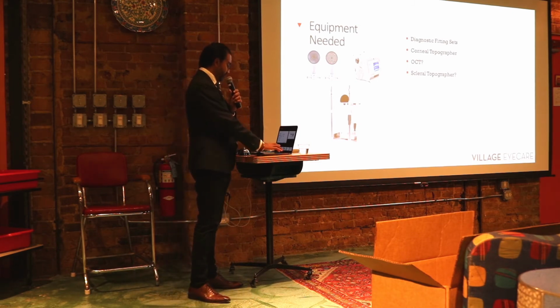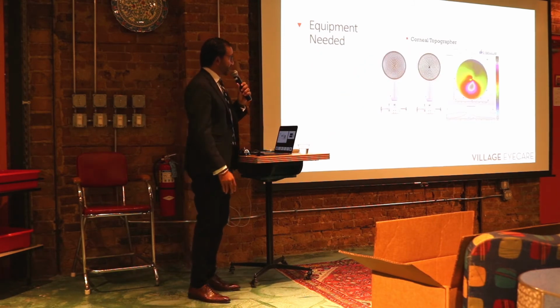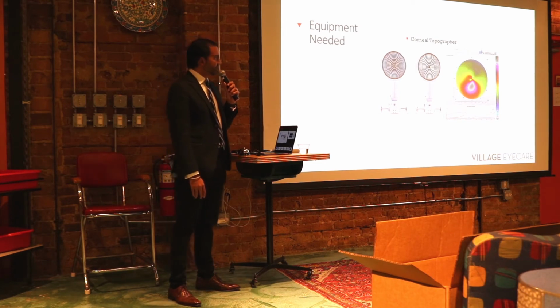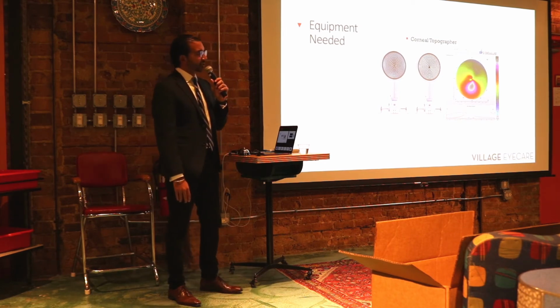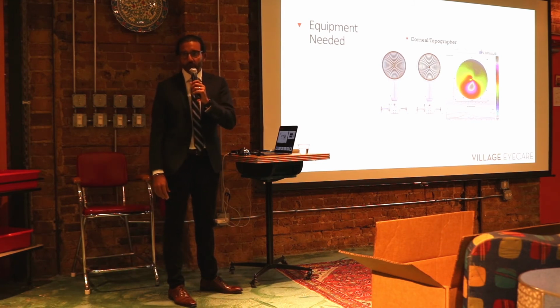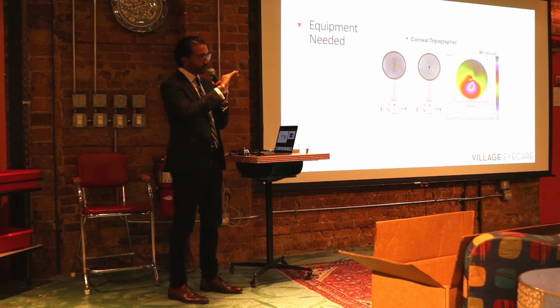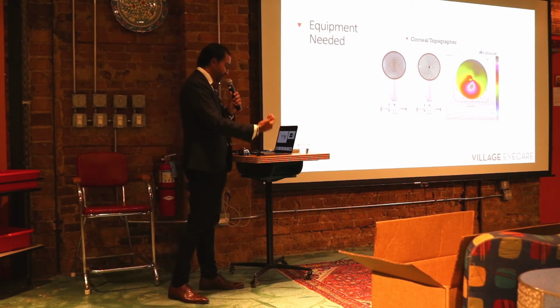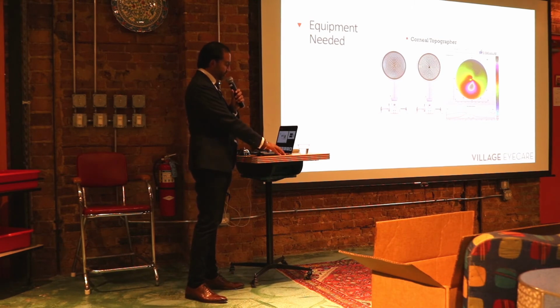Corneal topography, I think that's a mainstay in any optometric practice. If it's any type of contact lenses for that matter, from a diagnostic perspective, you have to have this to be able to diagnose these conditions. Strangely enough, with scleral lenses, once you have that topography, because scleral lenses don't touch the cornea, topography doesn't really come into play that much. You need to know the overall shape and profile of that cornea, but since we're vaulting over it, it doesn't impact the fit once you start going with the diagnostic lenses. But from a diagnostic standpoint, obviously topography is a must.